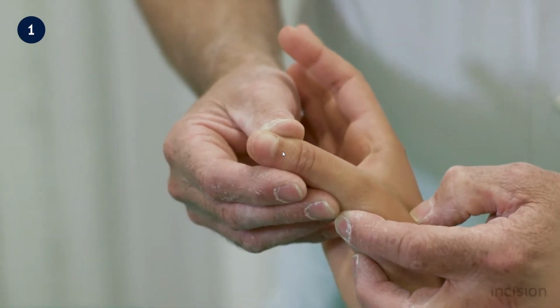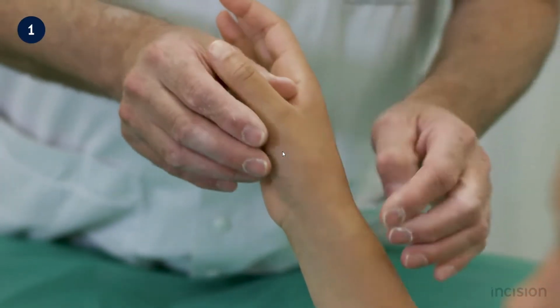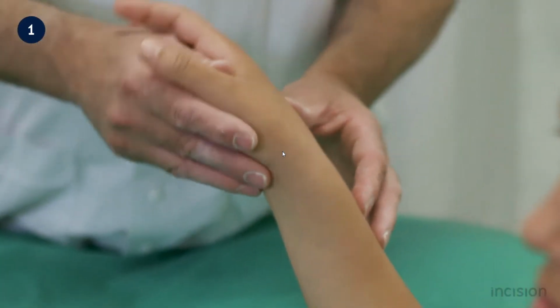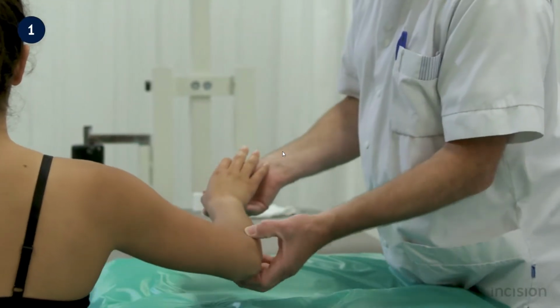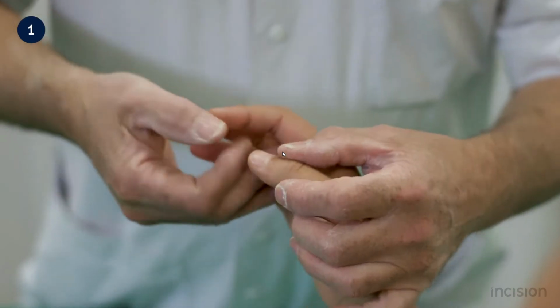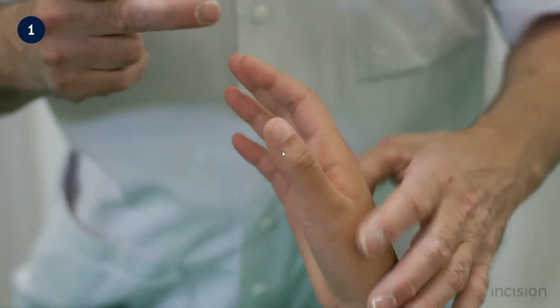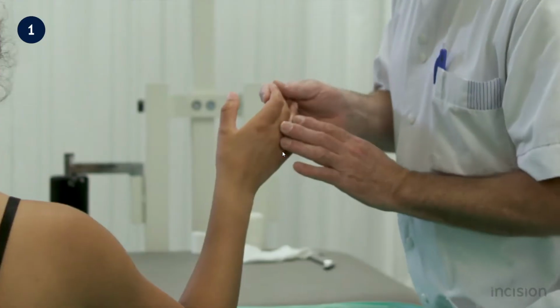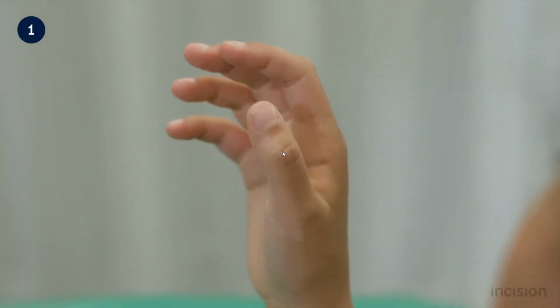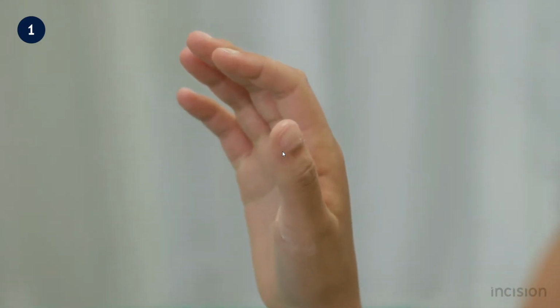Before applying the splint, the following adjacent joints and bones should be examined for injury: the interphalangeal joint, the anatomical snuff box, the wrist joint, and the elbow joint. The digits are examined to assess capillary refill and sensation. All these examinations are used to detect abnormalities so they can be acted on if necessary. Also, the findings can be compared to the physical examination after the splint has been applied.